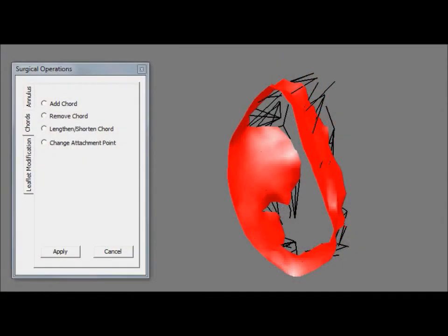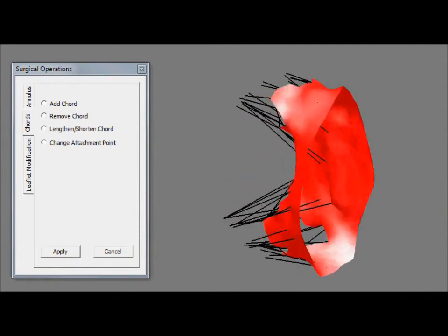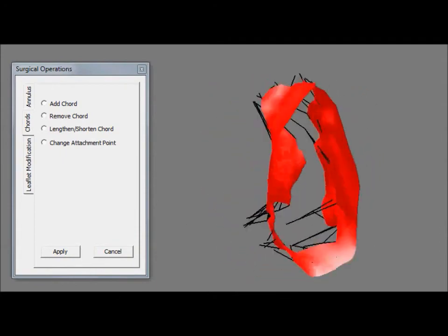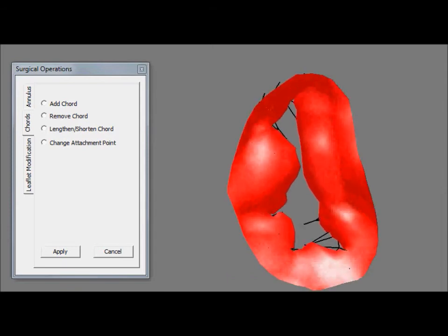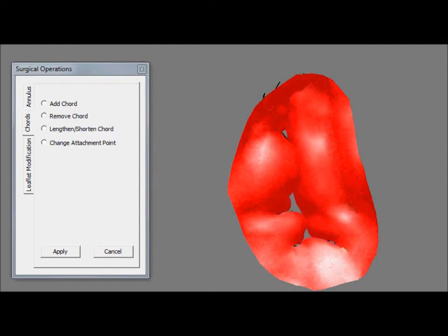One immediate benefit of virtualization is improved visibility. As you can see here, we can view the valve from any angle, facilitating valve analysis and modification. The valve can be simulated to closure in just a few seconds.